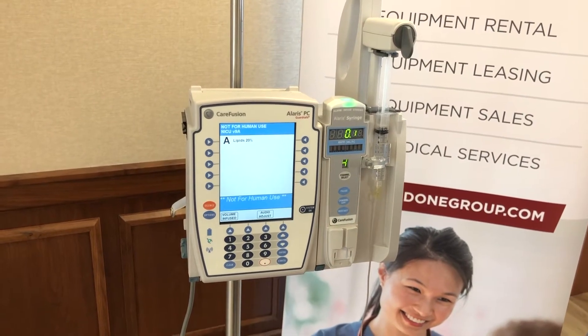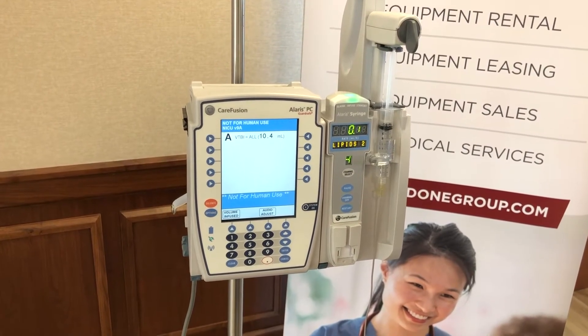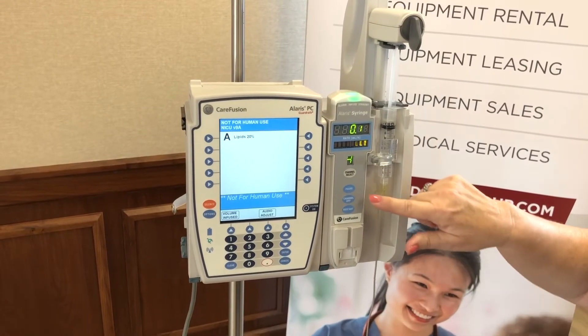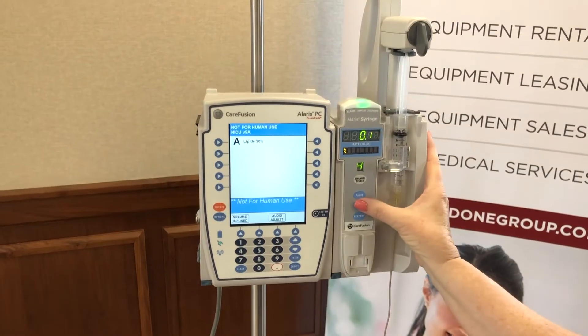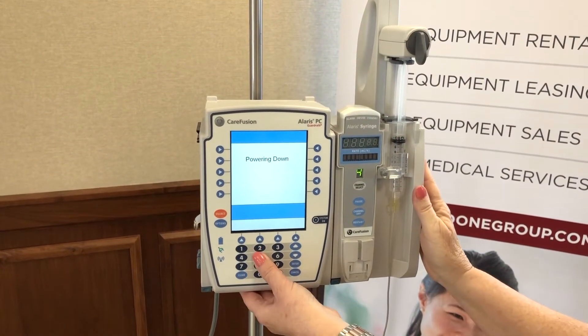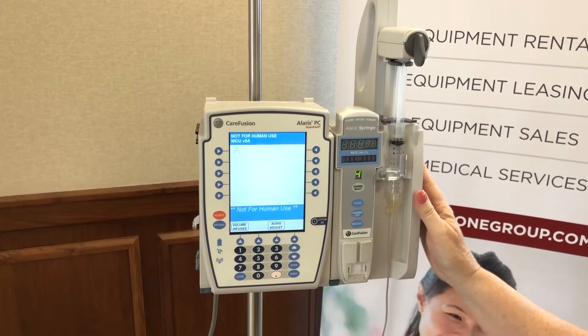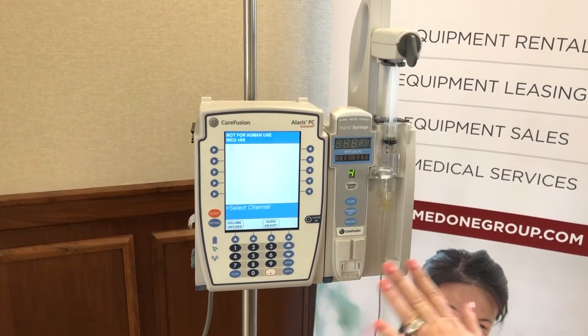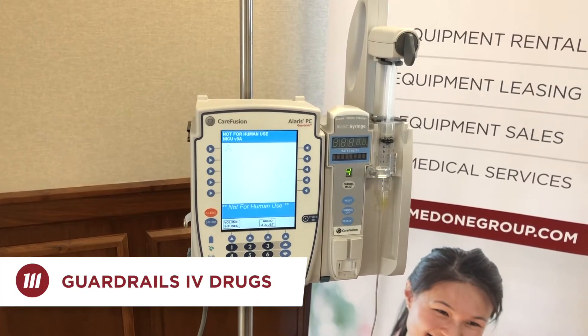Now we need to power this channel off to show a Guardrails IV drug scenario. Press and hold power off until you hear a chirp, then press any button on the keypad — that wipes that infusion away. Now we can demonstrate how to do a Guardrails IV drug.